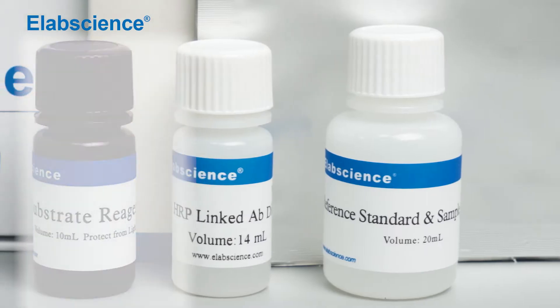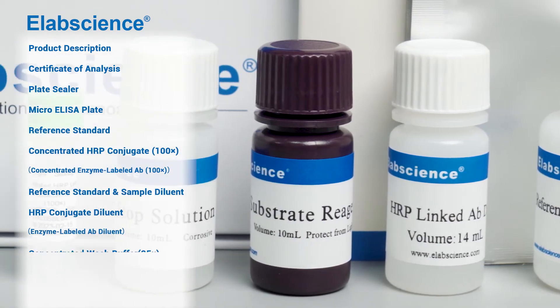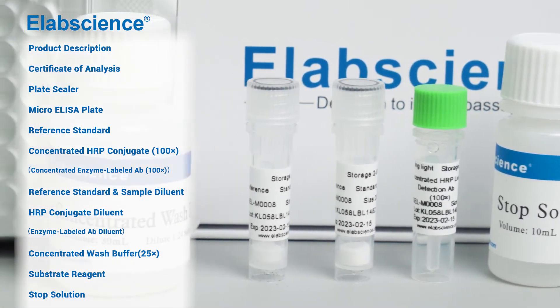Convenient storage. Take out the kit and equilibrate it to room temperature. Check its label and internal reagents and read the instructions carefully. If you have any questions, please contact the manufacturer in time.